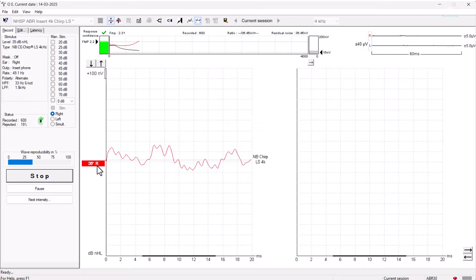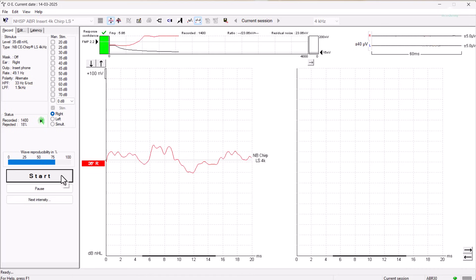The first waveform shows a good morphology with a large amplitude and the FMP criteria has been met at 600 sweeps, with a residual noise level of 36 nanovolts. However, the BSA guidance recommends that a minimum of 1000 sweeps should be tested, so averaging was not stopped at this point. As there was a strong possibility that this waveform could contribute to our final threshold or gold standard, and the average waveform was still varying in morphology, it was decided to continue testing for longer. At 1400 sweeps, the waveform morphology had settled down and wasn't changing as much with every packet of 100 sweeps tested, so the recording was stopped.